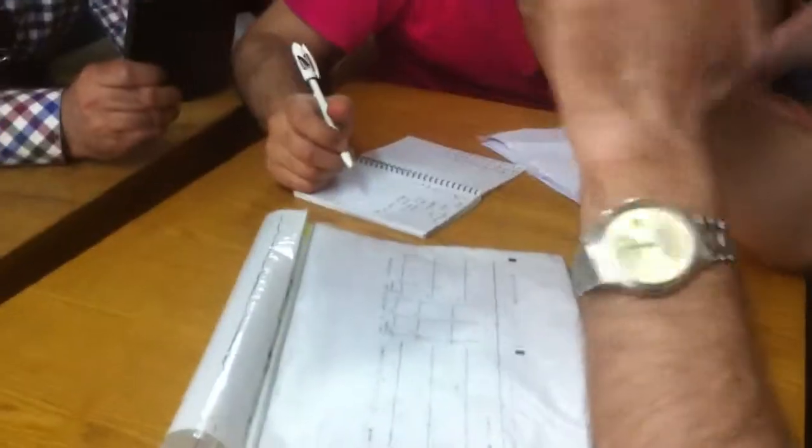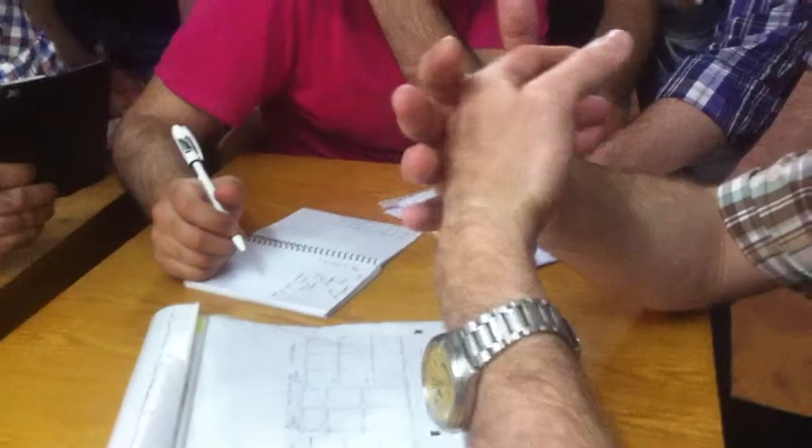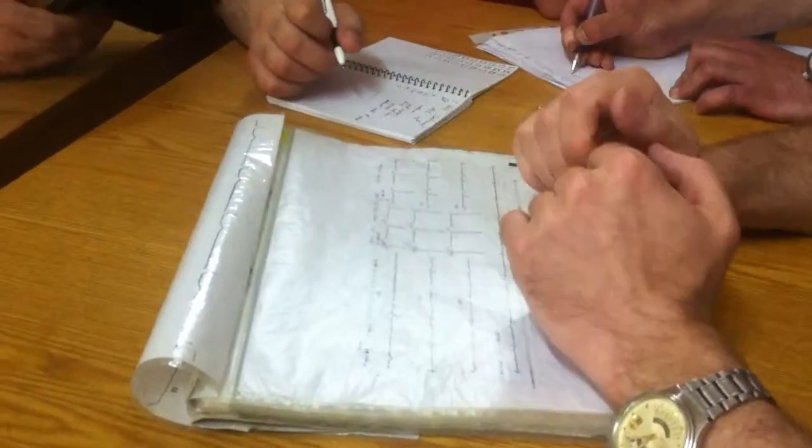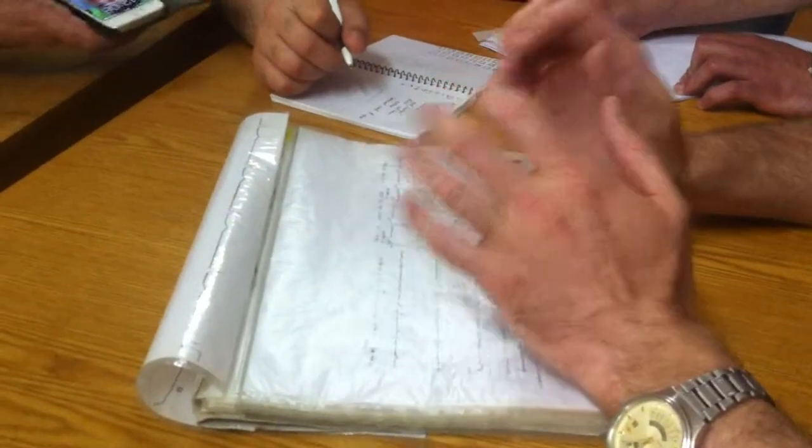Yeah. So when you obtain an ECG, first of all you should determine the rhythm. So what kinds of rhythms can there be? Normally it's sinus rhythm. The feature of sinus rhythm is the presence of a P wave before each QRS complex. If the P wave is connected with the QRS complex, it's sinus rhythm.